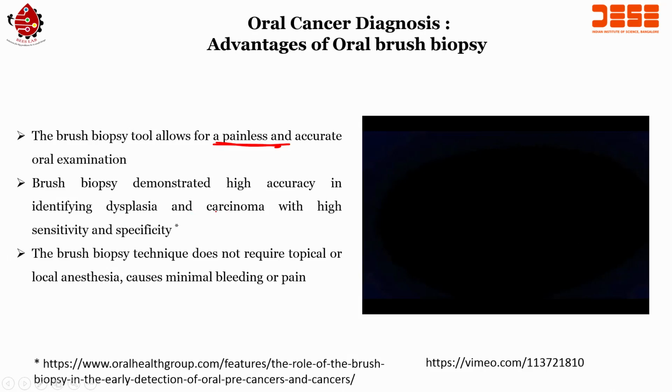Finally, the brush biopsy technique does not require topical or local anesthesia, and causes minimal bleeding or pain. Now, in other cases, if you use the biopsy technique, you have to anesthetize the patient, and it sometimes causes a lot of bleeding. But in the case of brush biopsy, we don't have to anesthetize the patient, and that is why local anesthesia is not required, and also there is minimal bleeding or pain. So, that is the advantage of the brush biopsy. So, let us see the video of how exactly brush biopsy is done in the actual case.